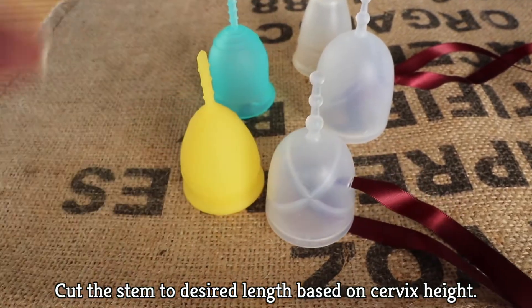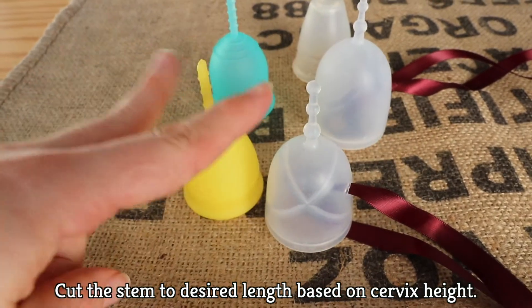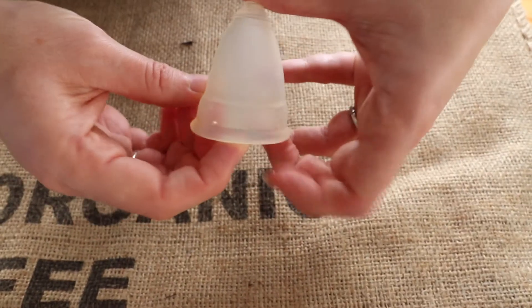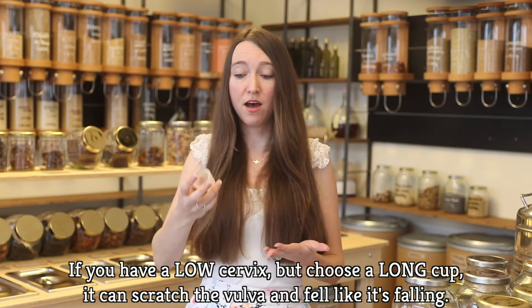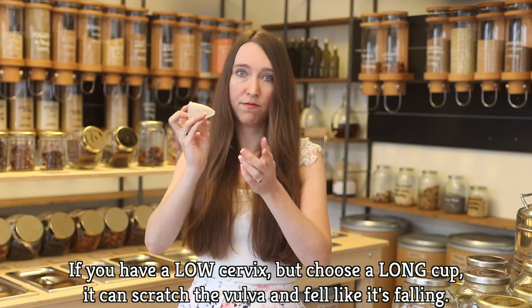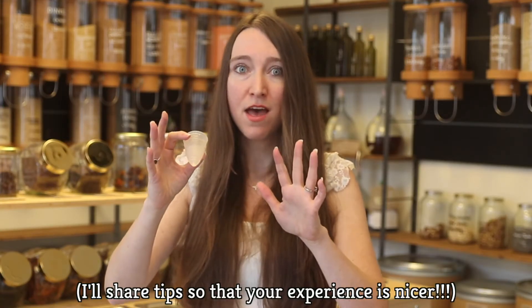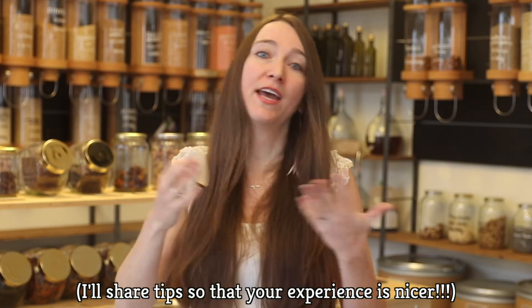Your cup comes with a stem, which you can cut to whatever length suits you to find your cup and pull it out. I actually cut mine off entirely. If you have a low cervix and get a large cup like a Diva Cup, the stem can scratch your vulva and feel like it's falling out. The first time I managed to get my Diva Cup in, it was awful getting it in, but once it was in I thought, great, I'll go to work. I rode my bike to work for one hour and the stem was scratching the entire time with no place to pull over to fix it — it was absolutely terrible. I learned that this cup was not the right fit for me.